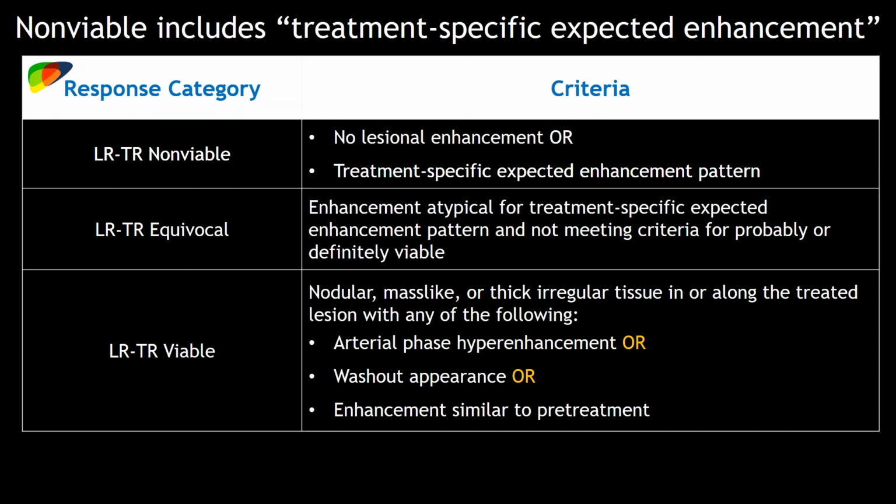Like I showed with the intra-arterial therapies, whether it's radiation versus non-radiation makes a huge difference in how you're going to interpret those patients. One thing I would say is, at U of M, we get a lot of outside referrals because we're a transplant center, and there are patients who come and we don't have any history, and I get the images to interpret for tumor board.